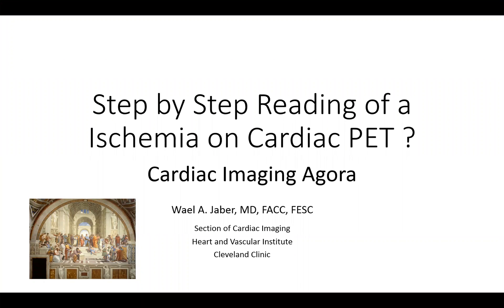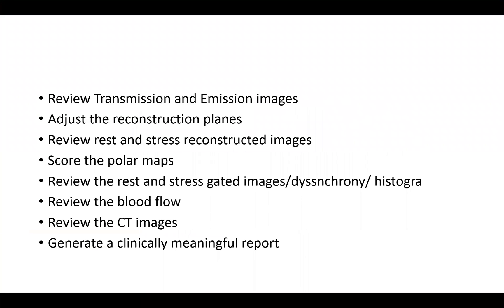Hello and welcome to another edition of Cardiac Imaging Agora. In this session we will analyze a PET ischemia study and try to correlate the finding of ischemia to some other not very uncommon pathology on ancillary imaging findings. We go back to our traditional checklist that we use every single time we read a perfusion study, whether PET or SPECT. In PET we add the myocardial blood flow, so if you follow this you will be able to generate a clinically meaningful report without missing important findings.